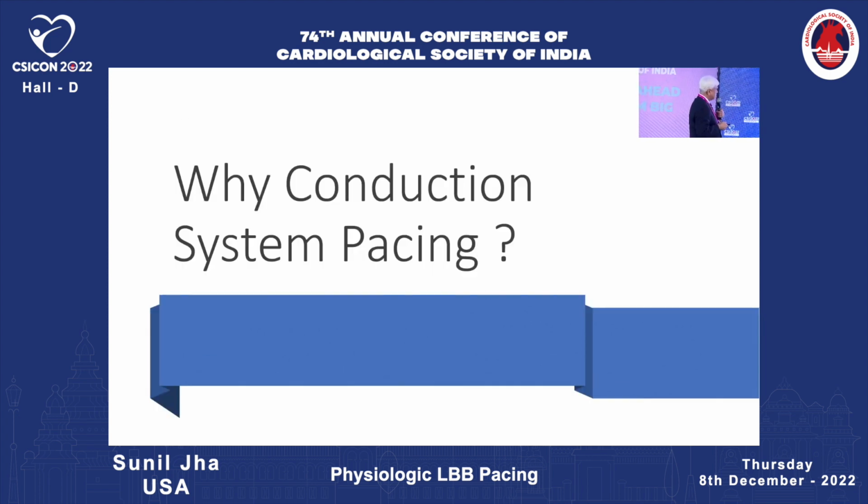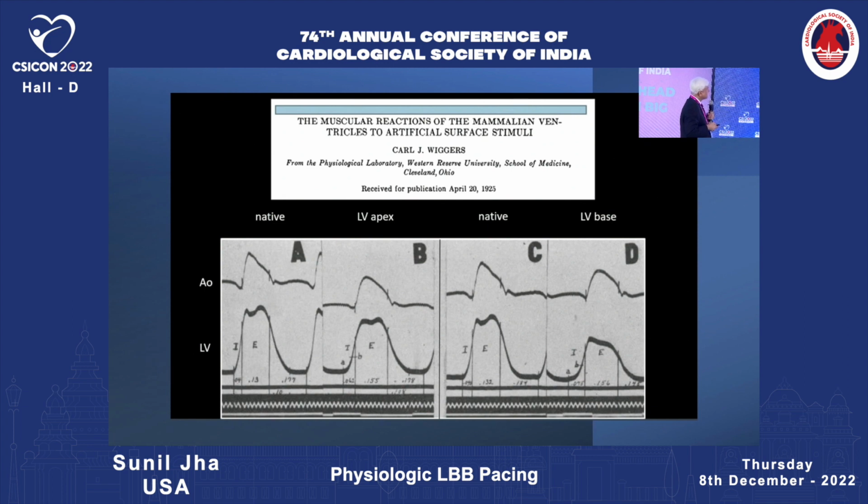So why conduction system pacing? I will take you back to this giant in the field of cardiac physiology, Dr. Wiggers. That time he showed, look at this, LV pacing, baseline LV and the aortic pressure. You pace the LV, and then aortic pressure goes down. The same thing again, native versus LV base. When you pace the LV apex or LV base, the aortic pressure goes down.